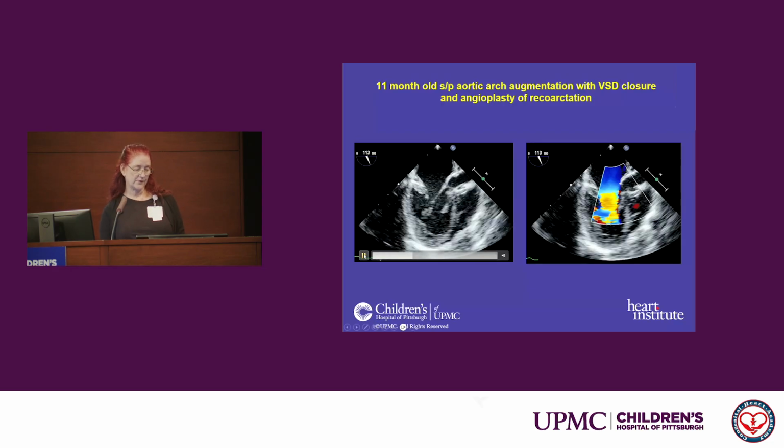All right, so this is about a 120 view by TEE. Child was asleep, so it wasn't a moving target anymore. And this is similar pictures to a parasternal long axis view. So you can see here the aortic valve. Here you can see the muscular sub-AS. What's also a little bit interesting to me, you can see this tendon here, which actually goes across and attaches to one of the papillary muscles, but I don't think is attached to the mitral valve.